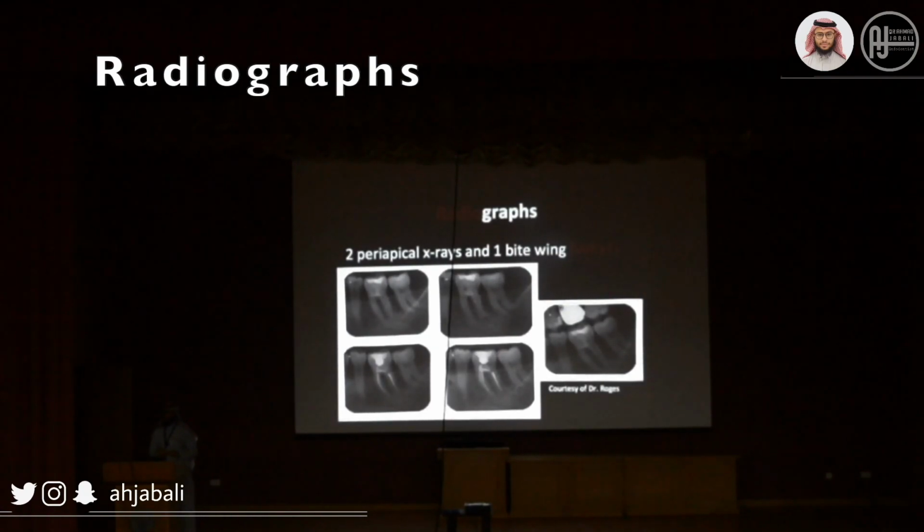Bitewing, why do we need to take a bitewing before we start root canal treatment? To see if the tooth is restorable or not. Also, I can measure the distance between the furcation area and the occlusal surface of the tooth before I go for penetration.